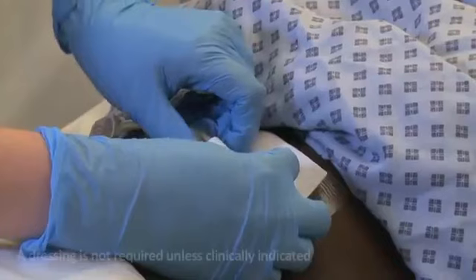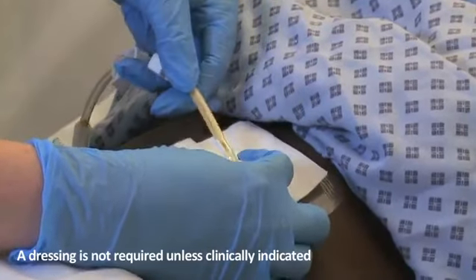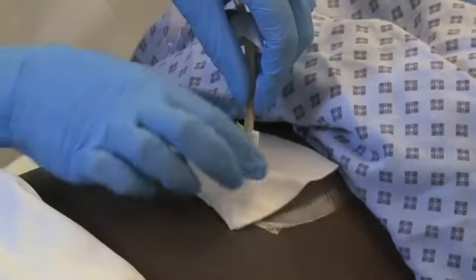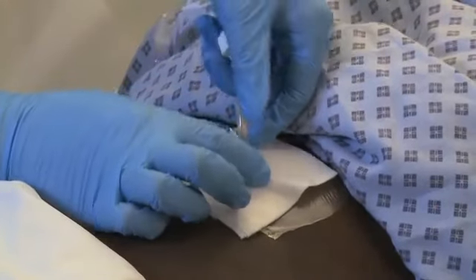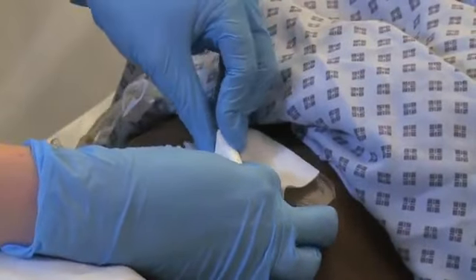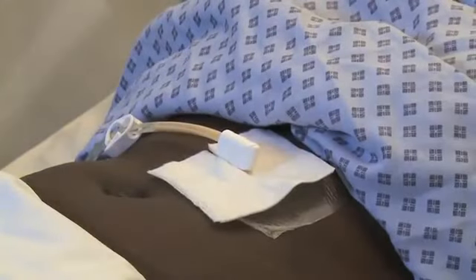Okay, so to loosen the external fixator, if you want it a bit loose to the skin, say it's quite tight, all you need to do is twist the top part and move it down the tube, and then the tube can be adjusted so the other part of the external fixator moves up and down. So we keep it about 0.5 centimetre away from the abdominal wall, clip the tube back in place, and then slide and twist until they clip together. The external fixator, clamp and Y adapter can all be replaced if required.